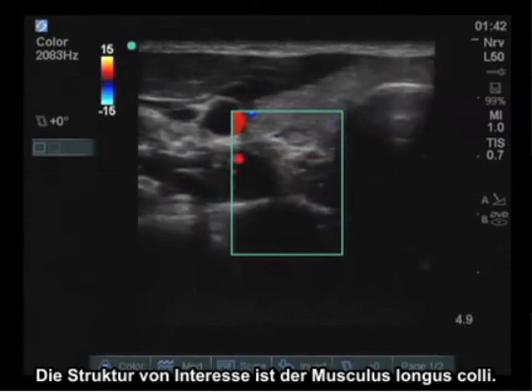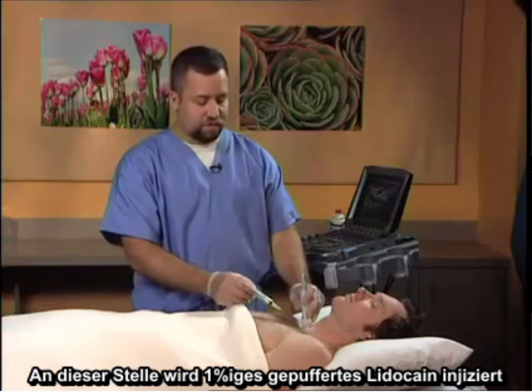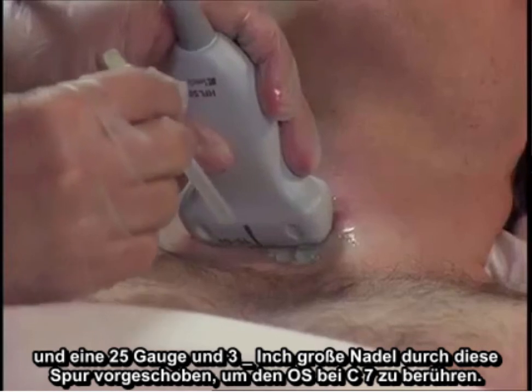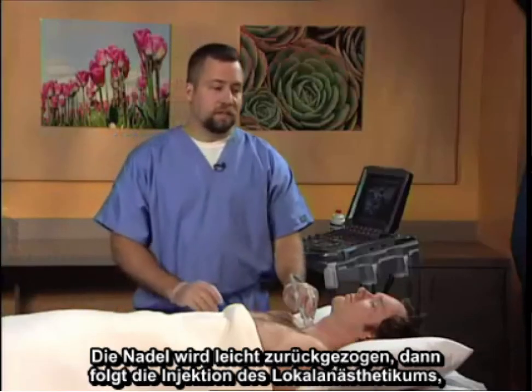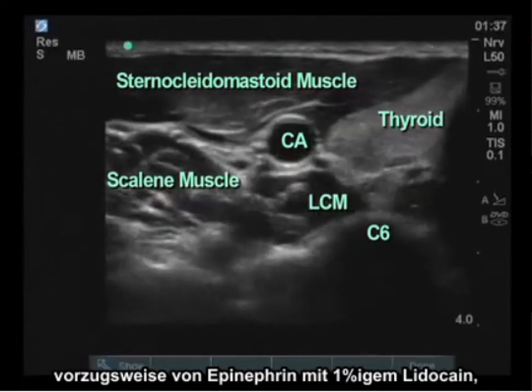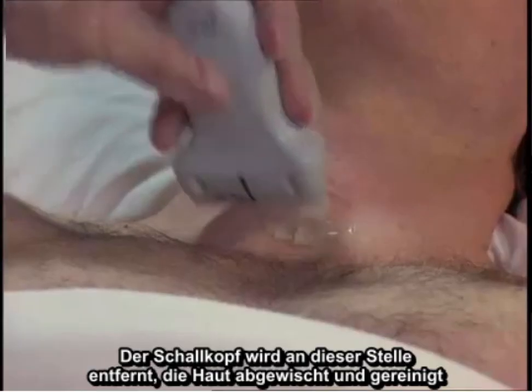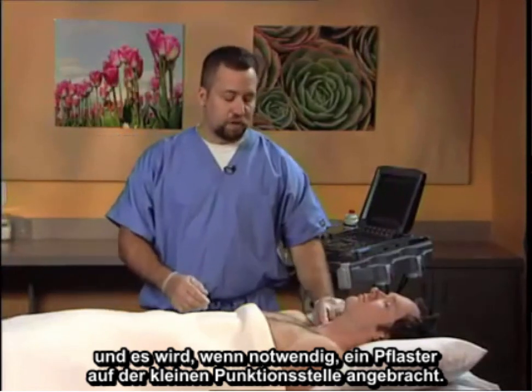The structure of interest is the longus colli muscle. At this point, local anesthetic — 1% buffered lidocaine — is injected, and a 25-gauge 3.5-inch needle is advanced through this track to contact the bone at C7. The needle is backed off slightly, and then the injection of local anesthetic, preferably epinephrine-containing 1% lidocaine, 6 to 7cc, is gently and slowly injected. The probe is then removed, the skin wiped and cleaned, and if needed, a band-aid placed over the small puncture site.